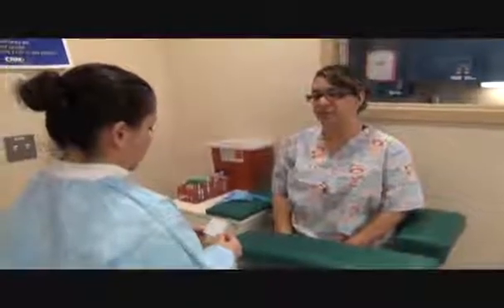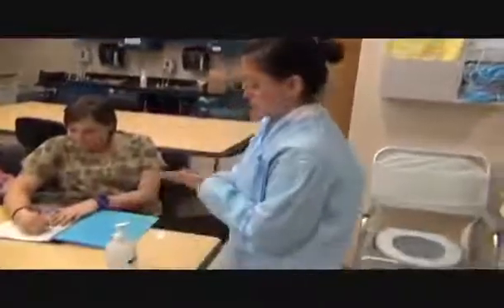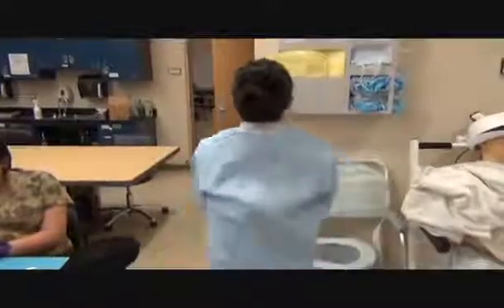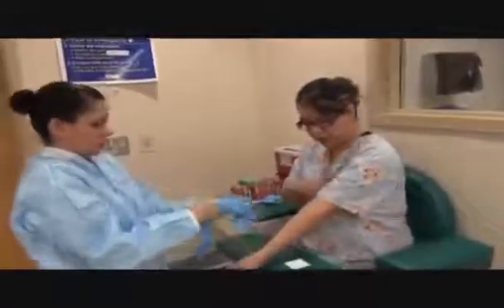Hi, my name is Desiree. I'm a CNN Phlebotomy student. Do I have permission to draw your blood? Yes. Can you please state your name and date of birth? Laura Viegas, 4/22/75. Okay, I'm going to go wash my hands and glove up and I'll be right back. Do you have an arm preference? I'm usually better on the left.